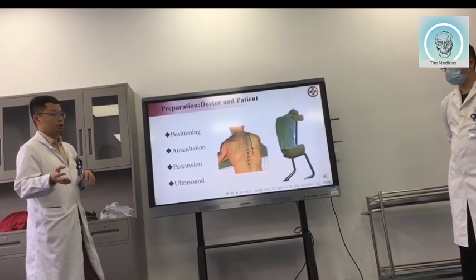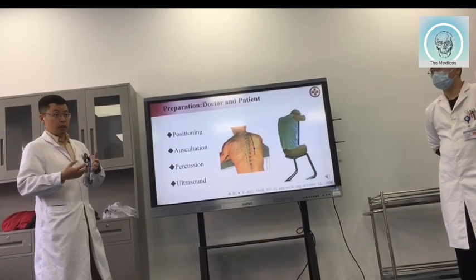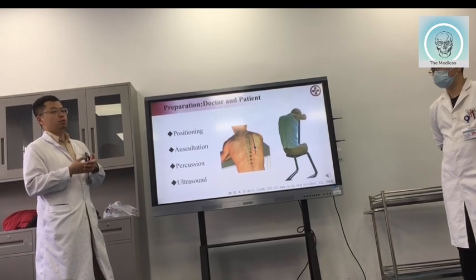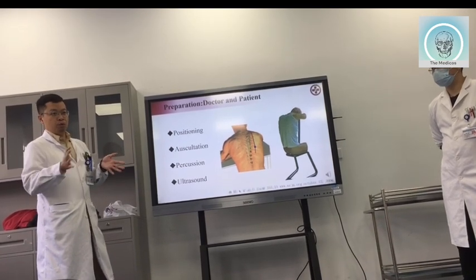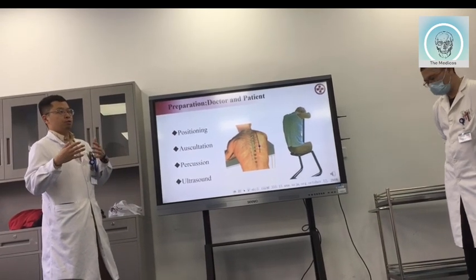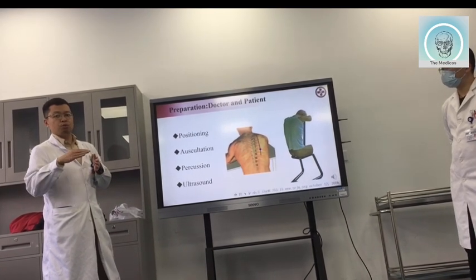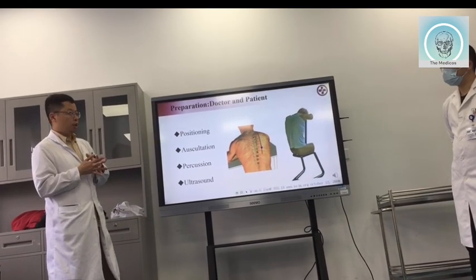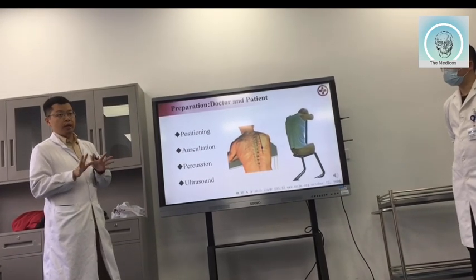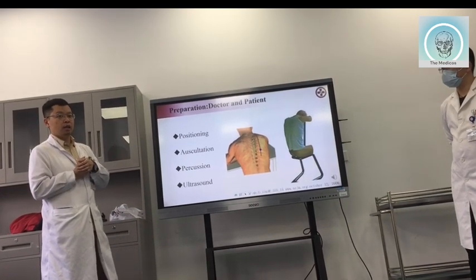Maybe you can ask the patient whether he or she is allergic to something, and you should ask the patient to go to the bathroom before you do this kind of procedure. And also you should figure out whether he or she can cooperate with this. You should do the evaluation. Then you should prepare yourself, wash your hands, and also put a mask on and put the hat on, okay?